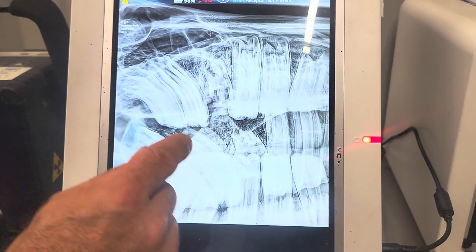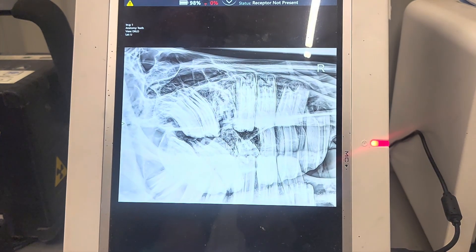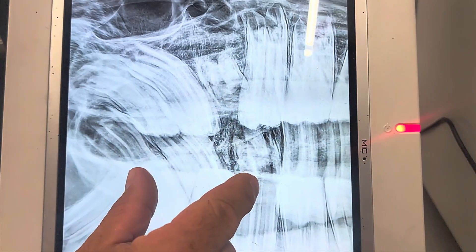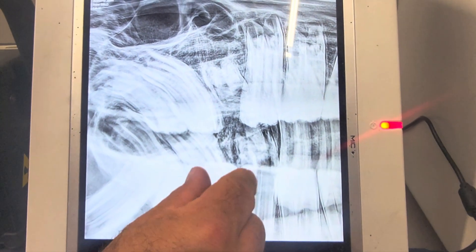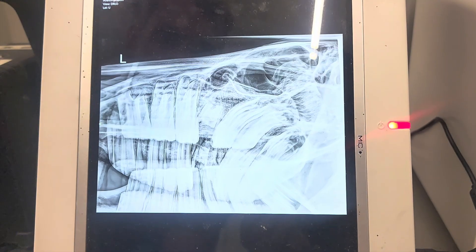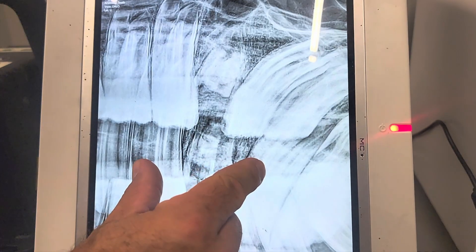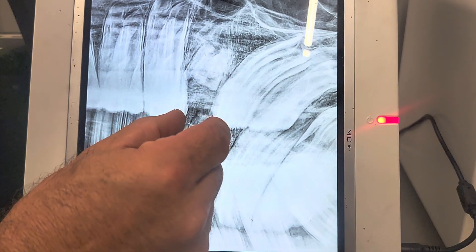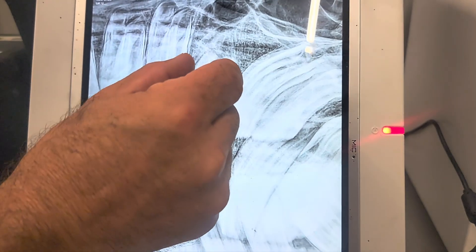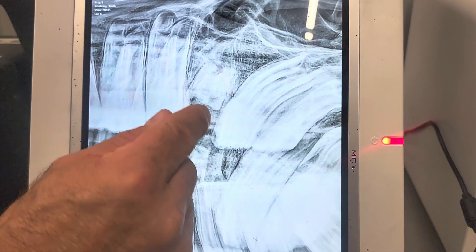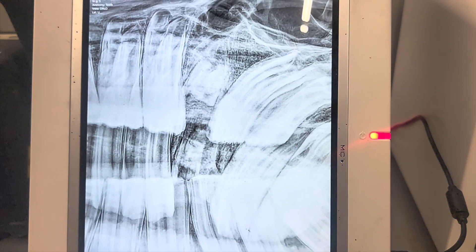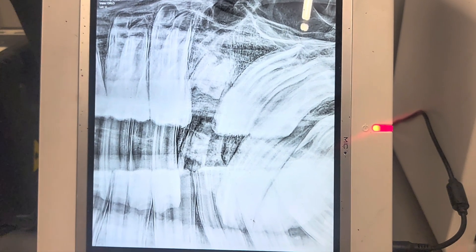This is on the horse's right side, so that's the 109. Then over here we have the 209, and we can see it's very trapped — there's a very small gap right in here, and then a big tooth that's all broken off with no clinical crown. This is going to be a difficult situation to treat surgically.